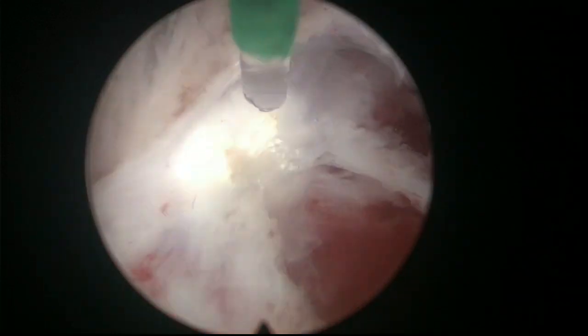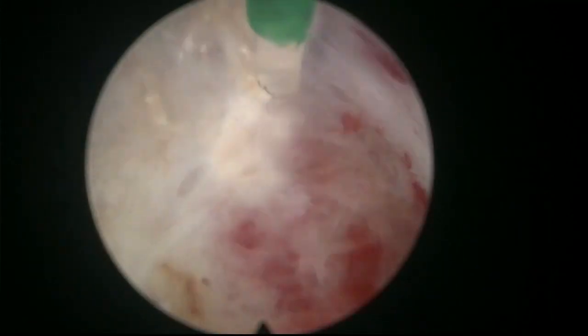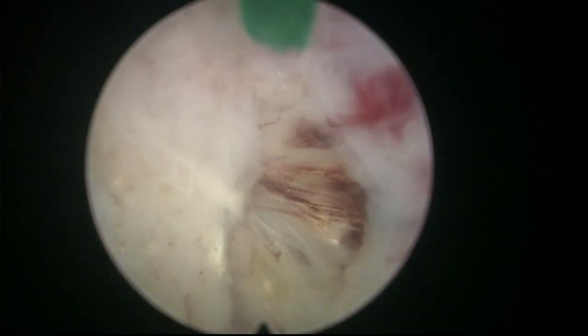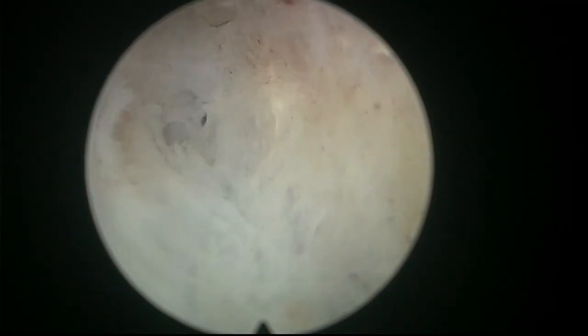Similar depth of dissection, because we want to keep a uniform progression from the apex to the bladder neck circumferentially. That's again, you see, there's like a ligament here. This is what I call the ligament, which is the transition from the lower plane to the lateral plane. And sometimes when you follow this plane, it looks as if it had to go up this way, but then you go lateral and you find that there's more tissue.